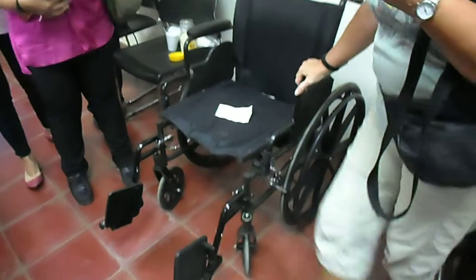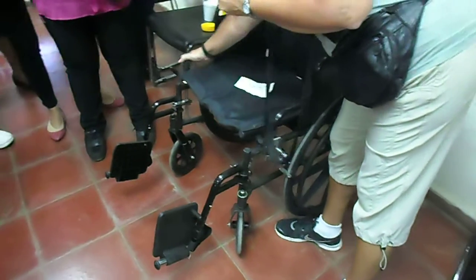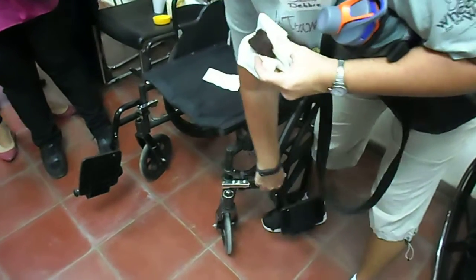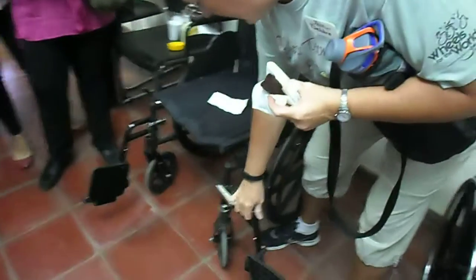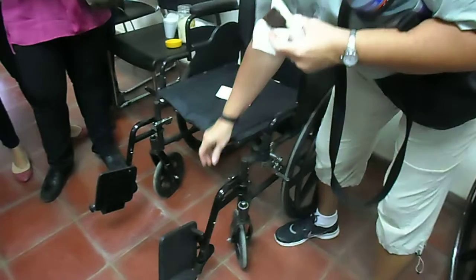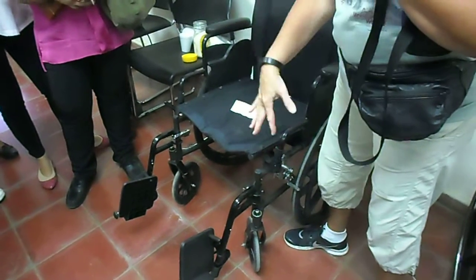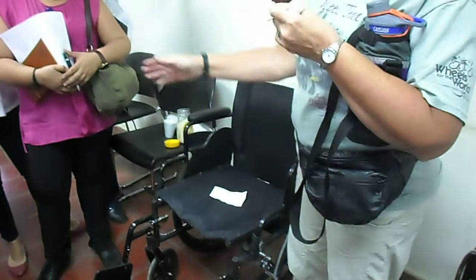There are a lot of kinds of pieces and parts. Of course brakes. These footrests flip away and also come off very easily. This would be an excellent chair for someone who stands to do transfers, any pivot transfers, because they can get the footrests out of the way and get them close up to whatever they're transferring on and off of.